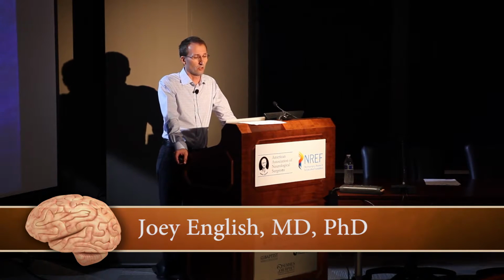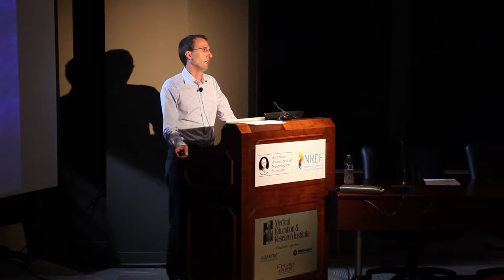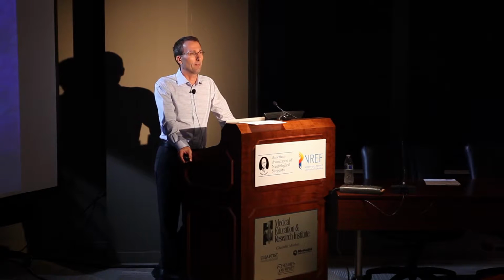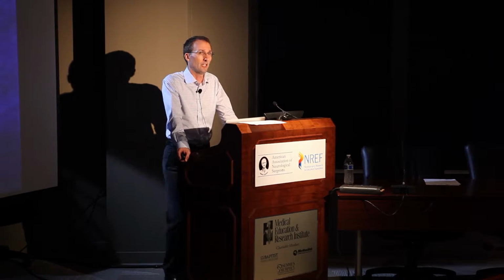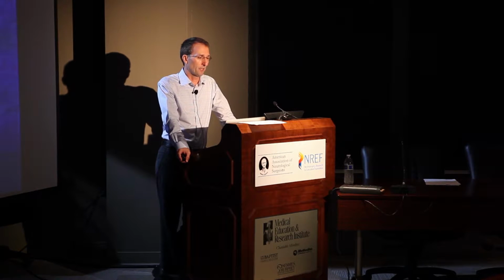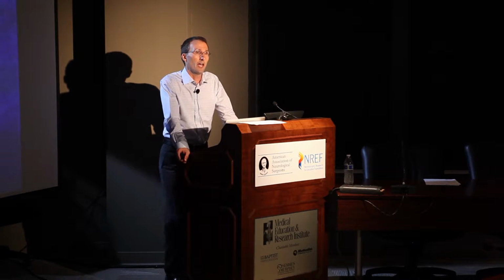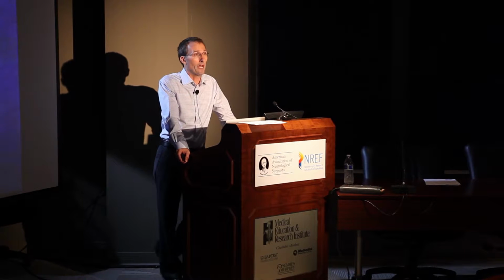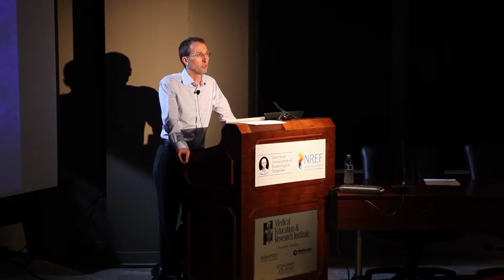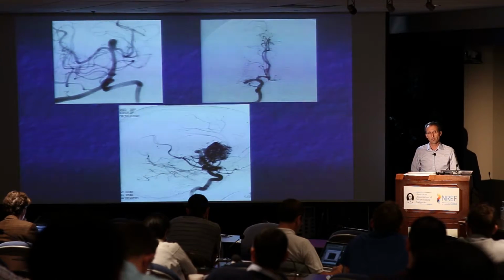They can be technically very difficult. But I would also say that the evaluation of the anatomical challenges and the details of the anatomy are more or less pretty straightforward, certainly with our modern-day imaging in the angiography suite and with cross-sectional imaging. I think most of us, by the time any of these three patients get to the angiography suite, already have some detailed CT, MR data where we really know largely what we're about to get into and what we're going to approach. And we probably have thought about how we're going to approach any individual case even before we do a single angiogram. And I will tell you, I think that dural fistula are very different from that.